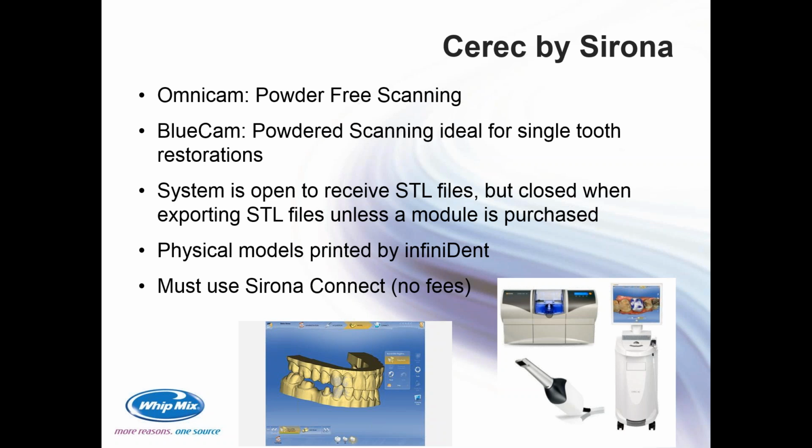They do offer physical models to be printed, which they do through Infinite, and then you must use their Sirona Connect system, although there are no fees with the Sirona Connect.